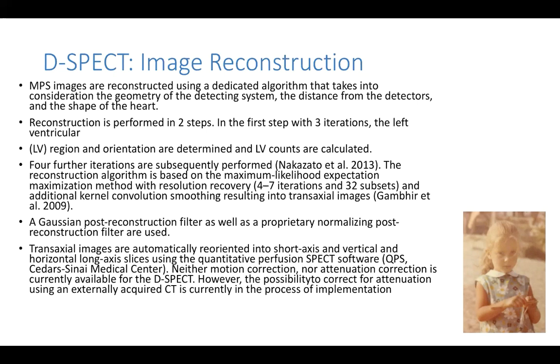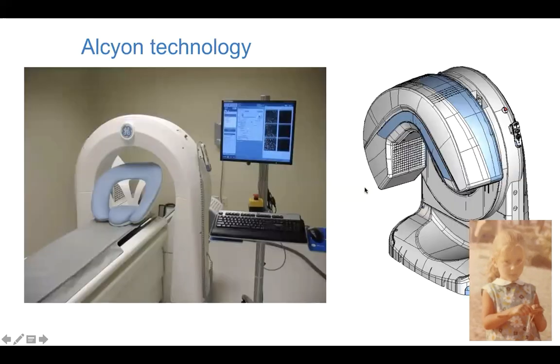The reconstruction algorithm is based on the maximum likelihood expectation maximization method with resolution recovery and additional kernel convolution smoothing, resulting in transaxial images. All this information is very well detailed in this literature that you can find here.